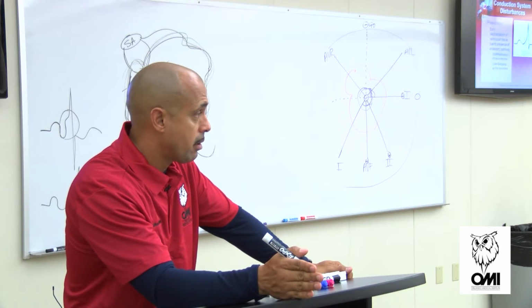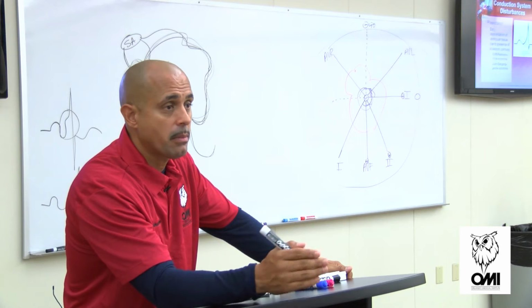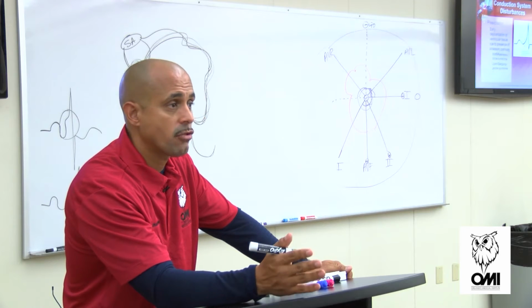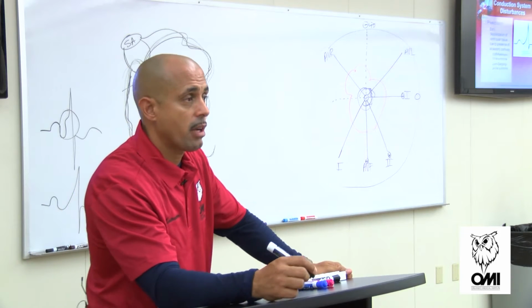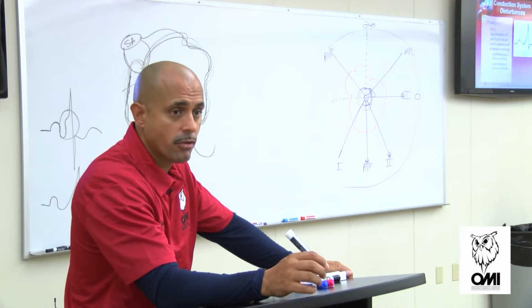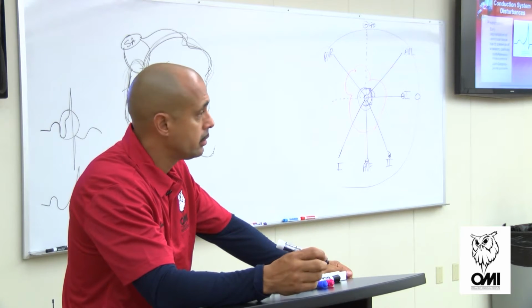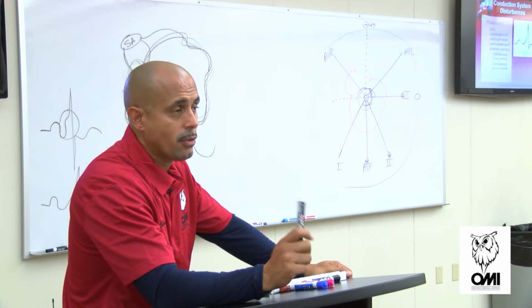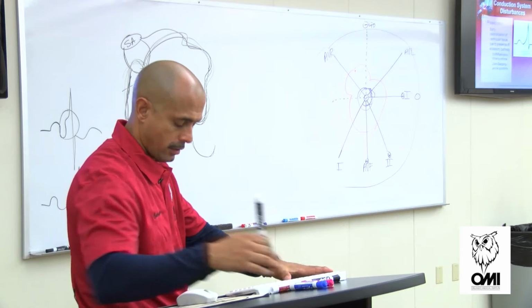But if I miss the WPW, I could jack my patient up, because their atrial rate could become their ventricular rate. If my rate is 300 atrial-wise, my ventricular rate becomes 300. How long do you think a patient could withstand a ventricular rate of 300? No, so he goes right into a lethal dysrhythmia. Does that make sense? That's why calcium channel blockers are contraindicated in WPW.